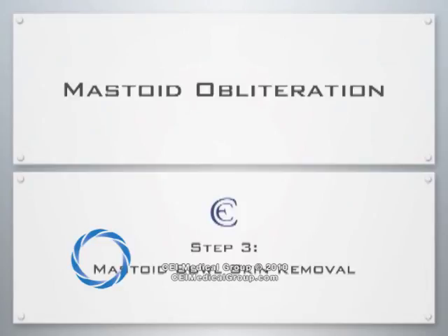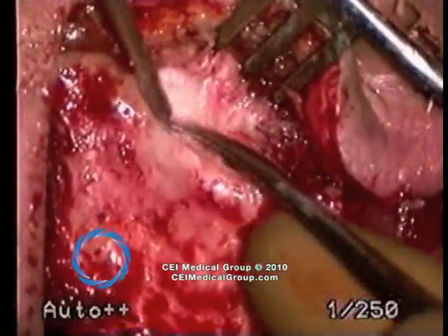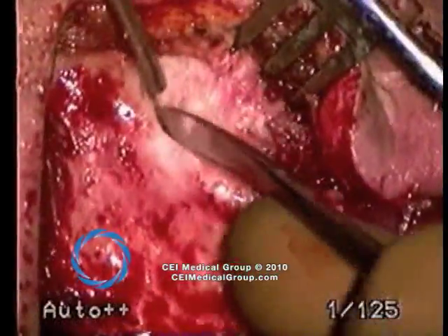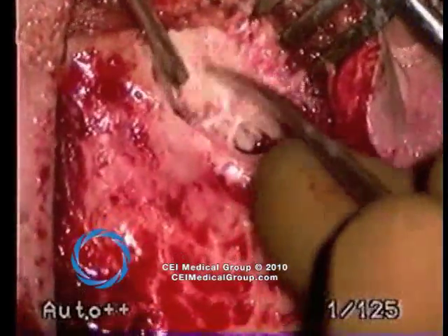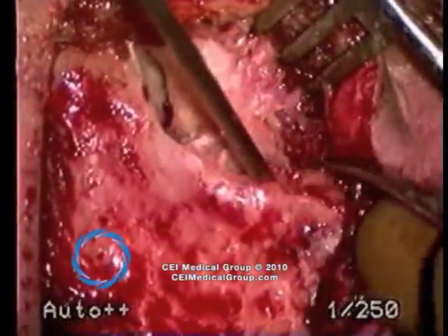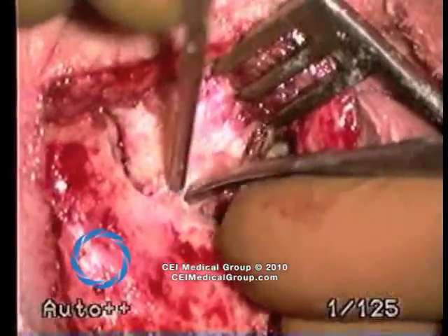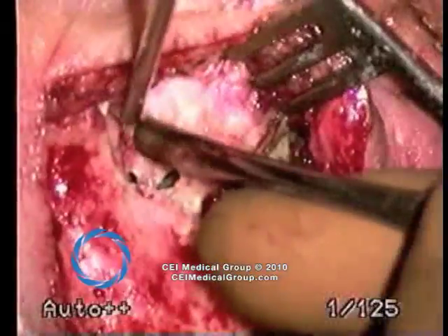Perhaps the most important portion of the procedure is mastoid bowl preparation and skin removal. You see the margin of the mastoid cavity with the skin being elevated from posteriorly. The surgeon attempts to keep the skin intact as much as possible throughout this portion of the procedure. Care is taken superiorly, as in approximately a third of patients a dural dehiscence is noted as well.